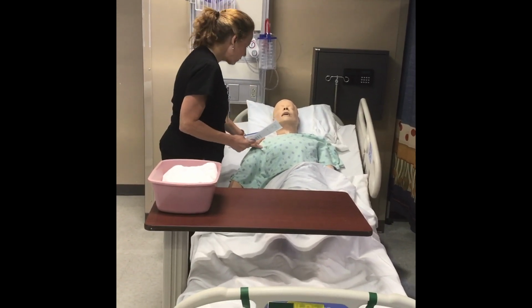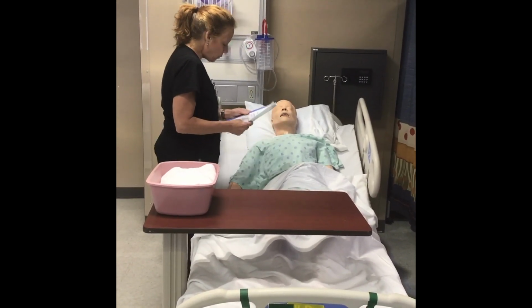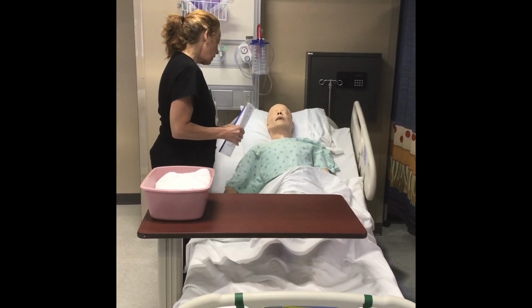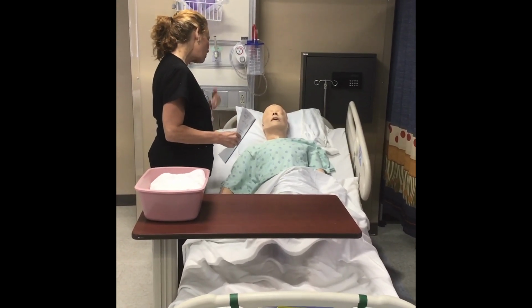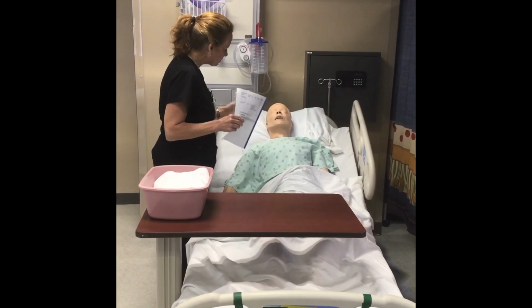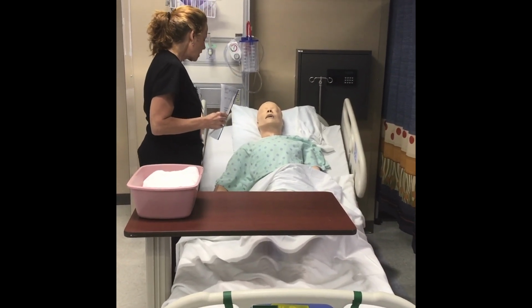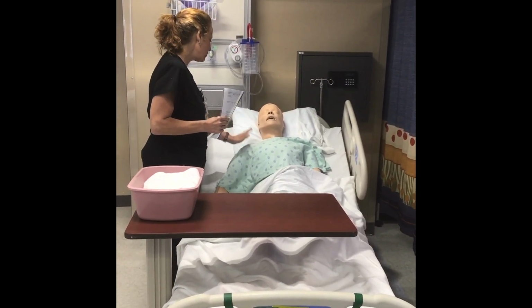Okay. The procedure that we're going to be doing today doesn't have any contraindications for those allergies, so we will proceed. So based on the patient chart that I have here, your physician has ordered an NG tube to be placed. Are you familiar with an NG tube? What's an NG tube? An NG tube is actually going to go through your nose, down to your throat, and into your stomach. And it's going to get rid of some of that gastric content that you have in your stomach right now. Because I understand you've had some nausea and vomiting today? Yes. Okay, so this will help relieve some of that buildup and that acid that you've got in your stomach. Is it okay if I proceed? Oh, please. Okay, let me just get my supplies ready and you can just relax.